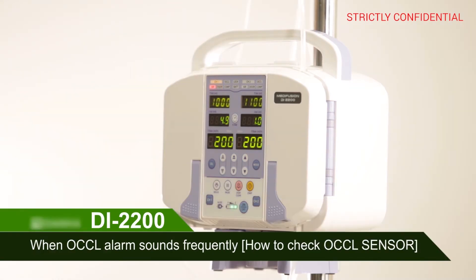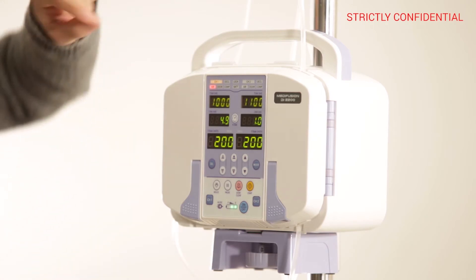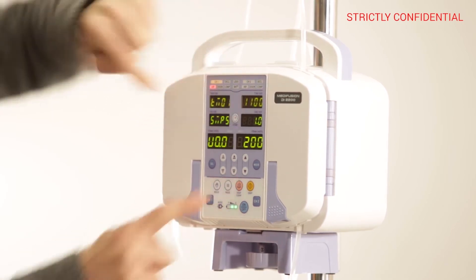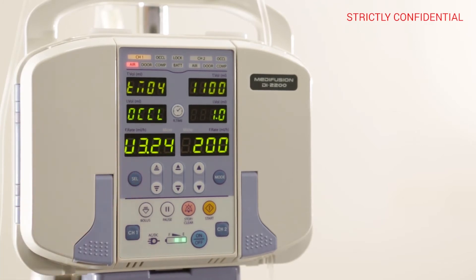When the OCCL alarm sounds frequently, how to check the OCCL sensor. After activating CHANNEL 1, press the R-TIME and STOP button at the same time for 3 seconds to enter the service mode. Press the SELL button 3 times to enter the OCCL mode.